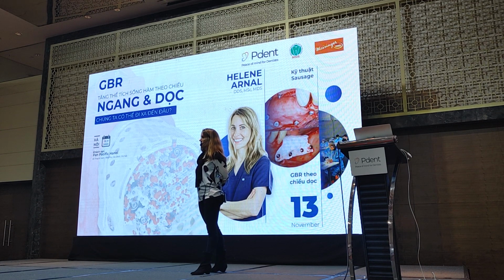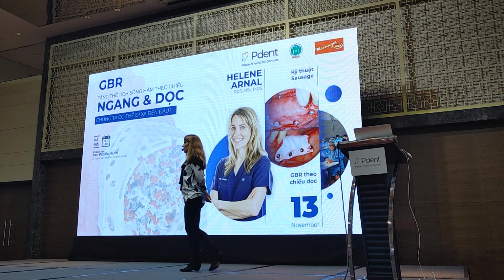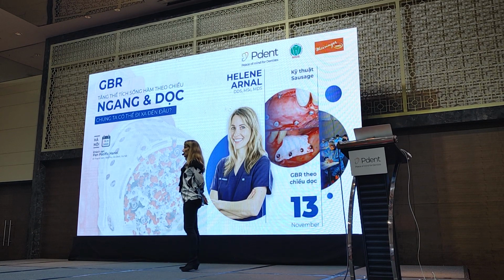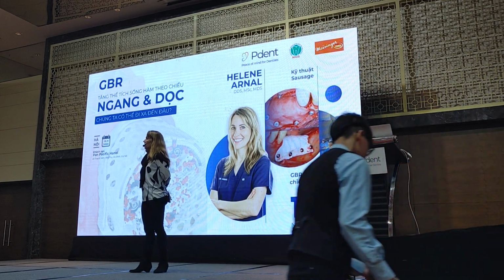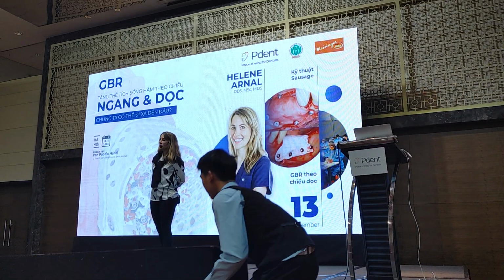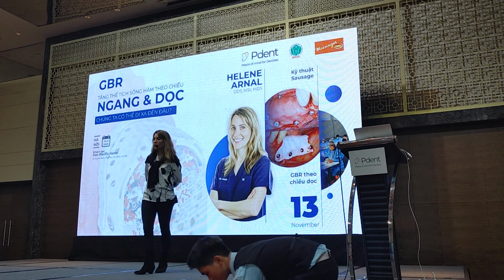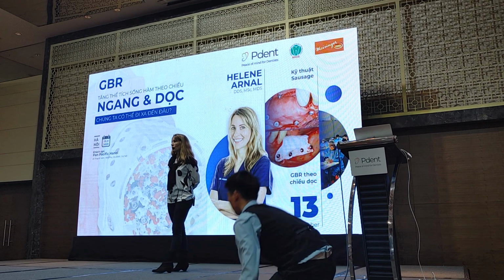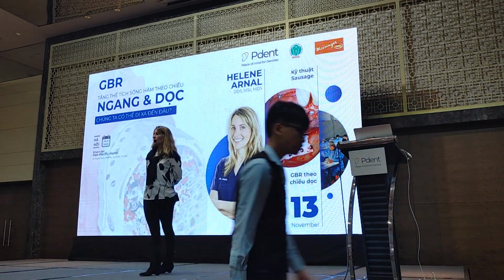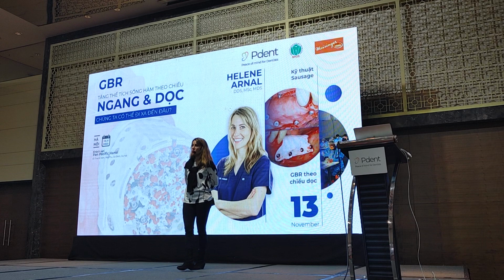You have a question about when we expand the flap, the lingual flap in the anterior zone: what we need to be careful about, what we need to notice. About the terminal branches of the sublingual artery? Yes, something like that. You need to isolate these terminal branches, because if you cut them, you will have much less blood supply for the graft, so it's not good. And potentially it can bleed a lot, so you will have to suture it, or it's a complication for your surgery.